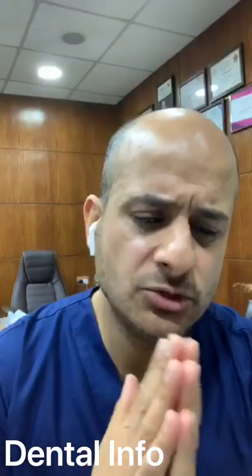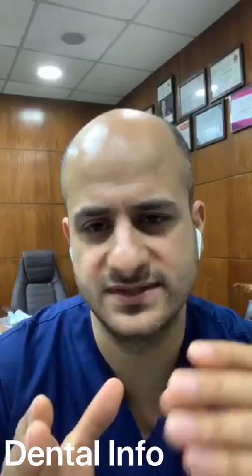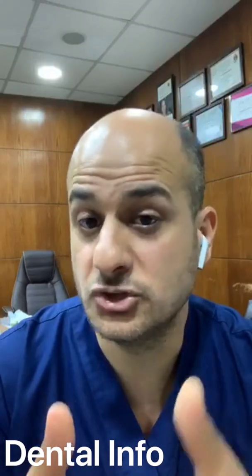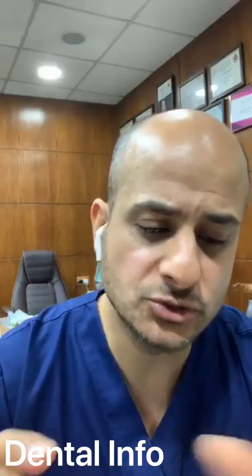Dr. Amani is asking if I'm using bioceramic sealer. If you are using bioceramic sealer, I don't recommend using the warm vertical compaction technique with it. You can go just with single cone or multiple cones with the bioceramic sealer, and that's enough. We had a very nice lecture with Dr. Talal Nahlawi a couple of days ago. He was talking about bioceramic sealers and how you can inject it and put cones inside. So I don't recommend it. Why? Because when you heat bioceramic sealer, it will set and be like a stone immediately.